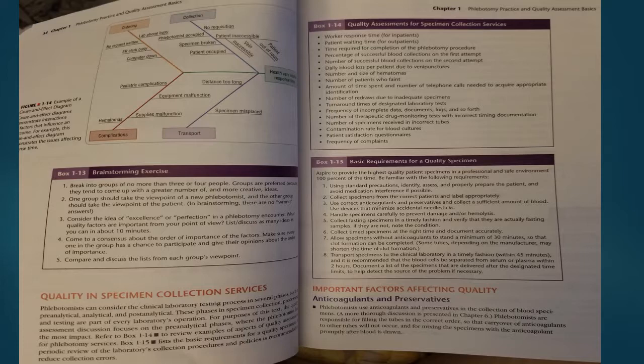4, handle specimens carefully to prevent damage and/or hemolysis. 5, collect fasting specimens in a timely fashion and verify that they are actually fasting samples. If they are not, note the condition. 6, collect timed specimens at the right time and document accurately. 7, allow specimens without anticoagulants to stand a minimum of 30 minutes so that clot formation can be completed. Some tubes, depending on the manufacturer, may shorten the time of clot formation.